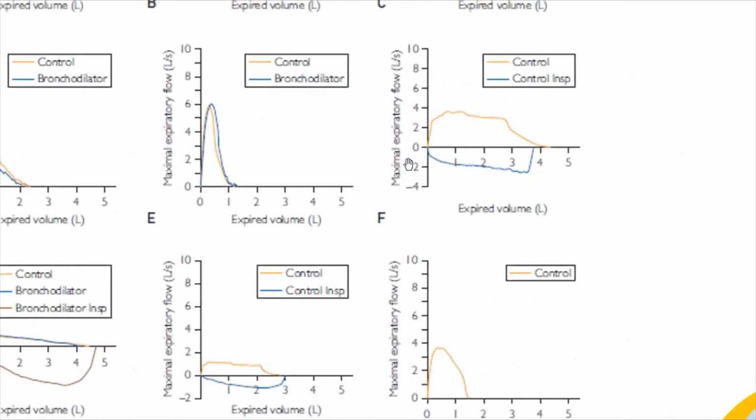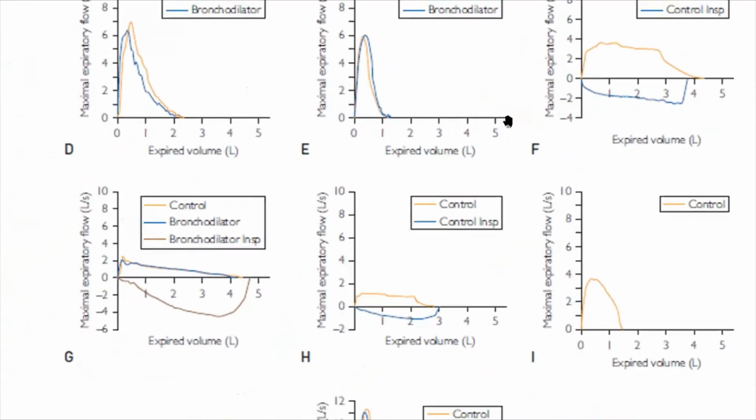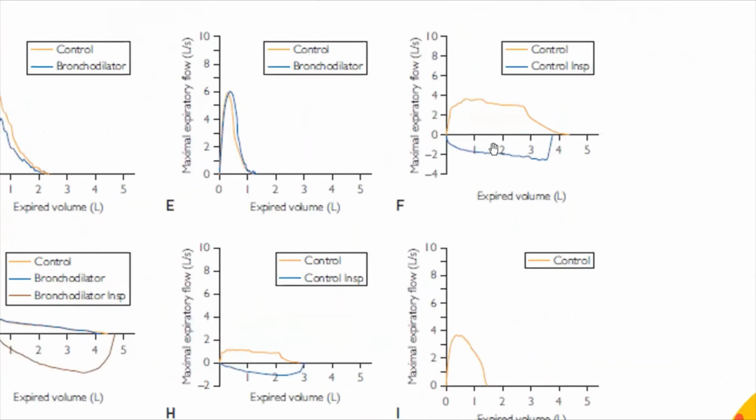Okay, F. Here it looks like a fixed one, but where is the flattening more, expiration or inspiration?